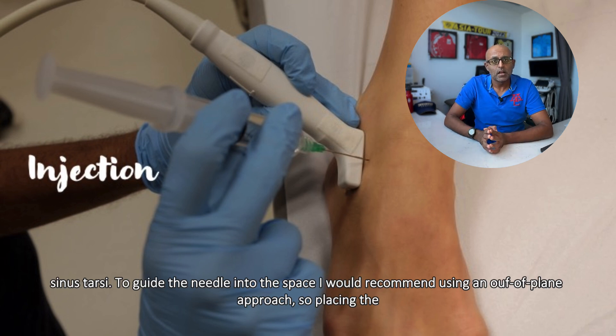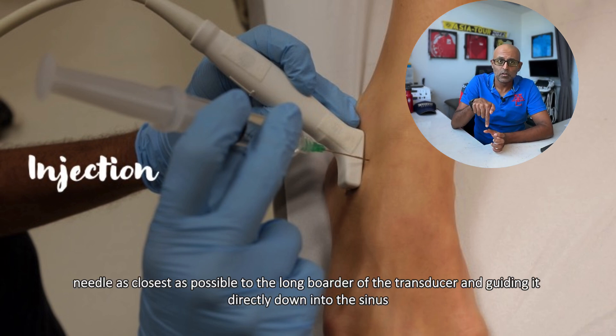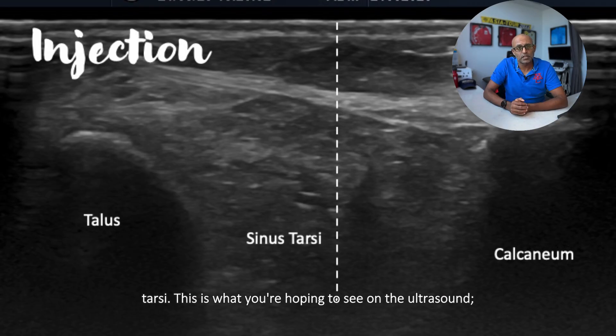To guide the needle into this space, I would recommend using an out-of-plane approach — placing the needle as close as possible to the long border of the transducer and guiding it directly down into the sinus tarsi. And this is what you're hoping to see on the ultrasound.